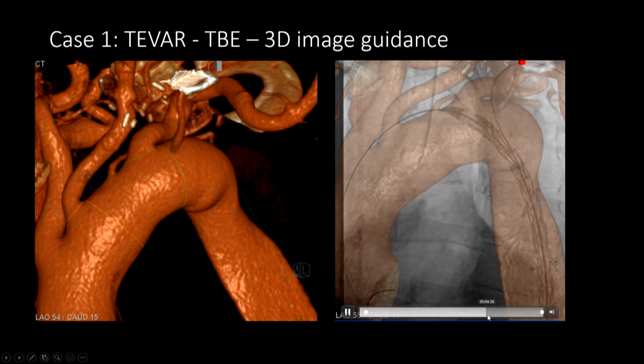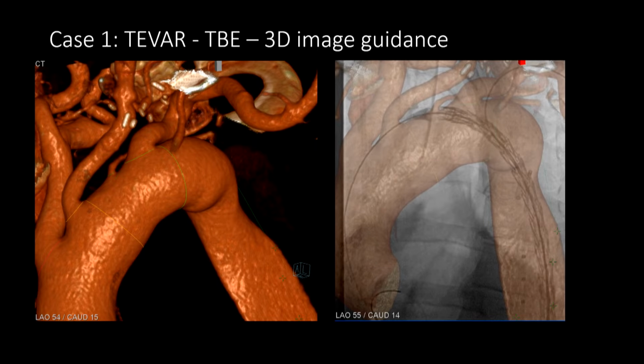So I have a question for you. Sure. Obviously when you put a stiff wire around, it changes the geometry of the aorta. Now you put a stiffer device around, that also changes things. How often do you end up having to shift your fiducial markers around?